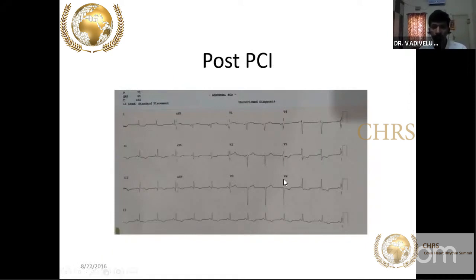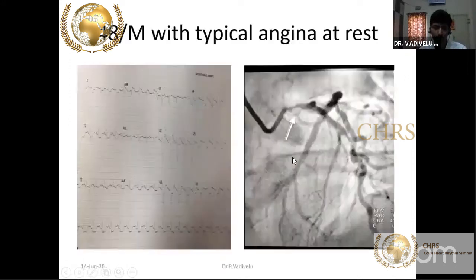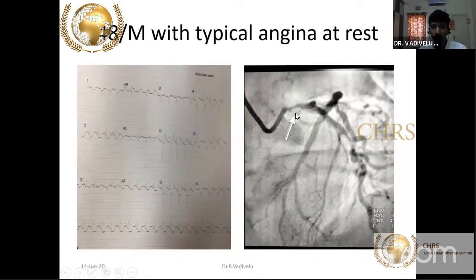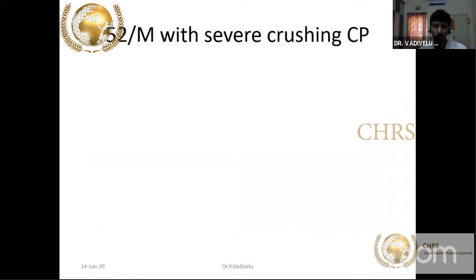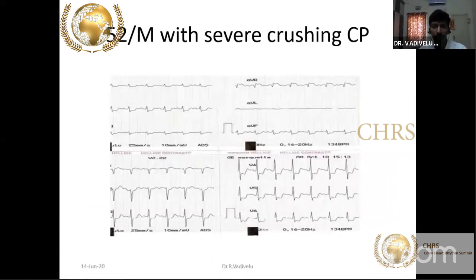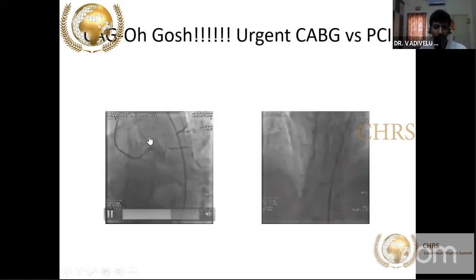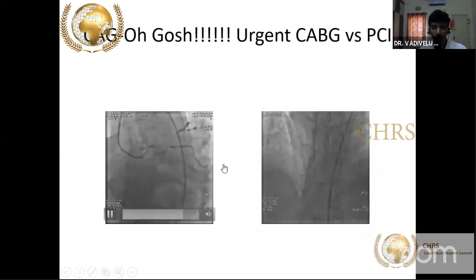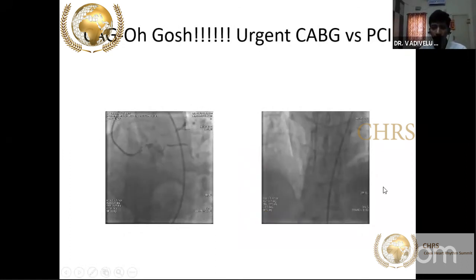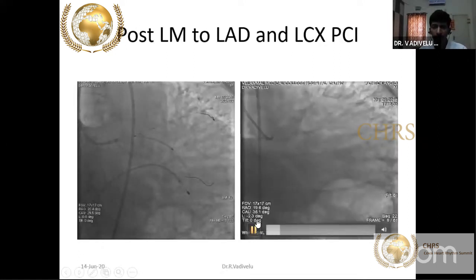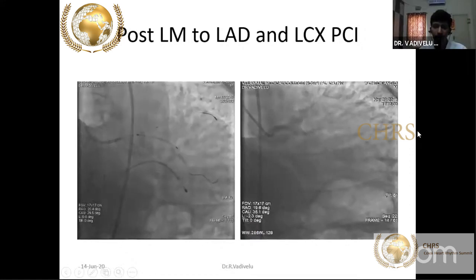Post-PCI, the ECG normalized. Another patient also showed diffuse ST segment depression in II, III, AVF, V5, V6, with ST elevation in AVR — very critical left main disease, treated with CABG and changes resolved. Yet another patient showed diffuse ST segment depression and ST elevation in AVR, with distal LMCA completely occluded and thrombosed, and LCx also diseased — underwent successful stenting of LMCA to LAD and LMCA to LCx.